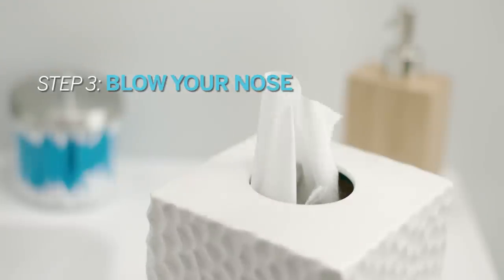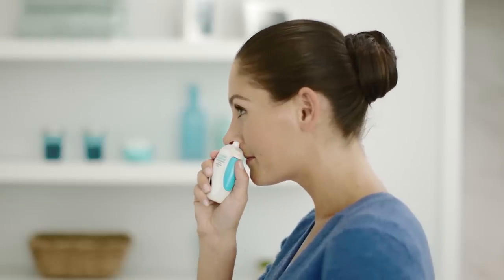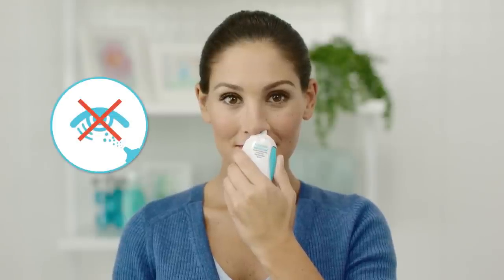Before using Flonase Sensimist, blow your nose gently to clear your nostrils. Put the tip of the spray bottle into your nostril and tilt your head forward while keeping the bottle upright. Only the tip should go inside. Be sure to aim slightly away from the center of your nose. Remember, Flonase Sensimist is only to be used in the nose. Do not spray in your eyes.